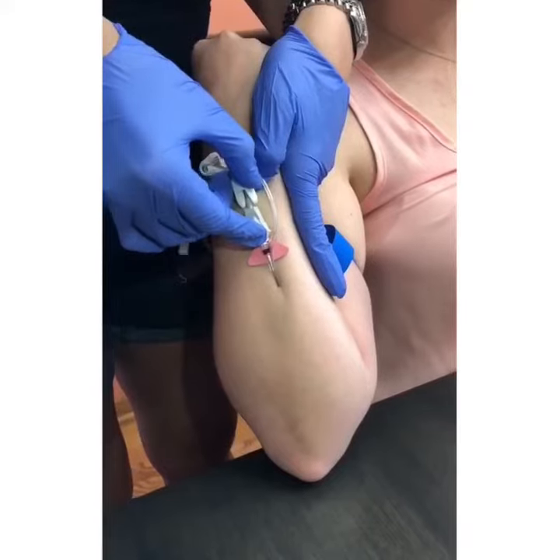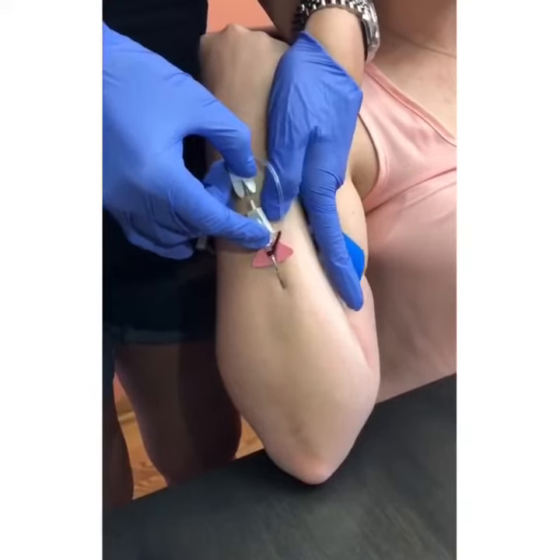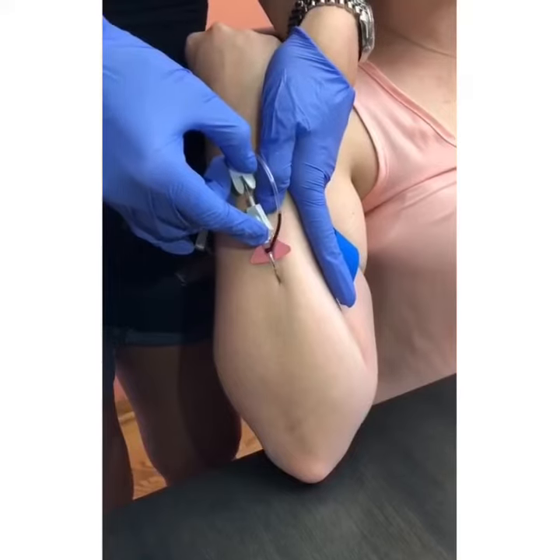If you have to, reposition your thumb again to tighten the skin. This will make it much easier to glide the catheter into the vein.